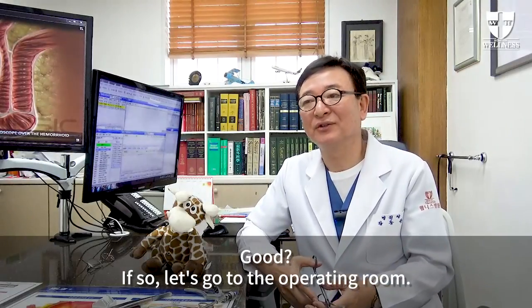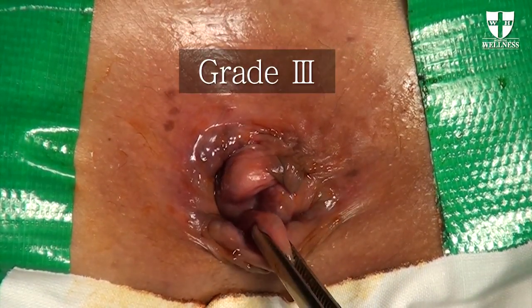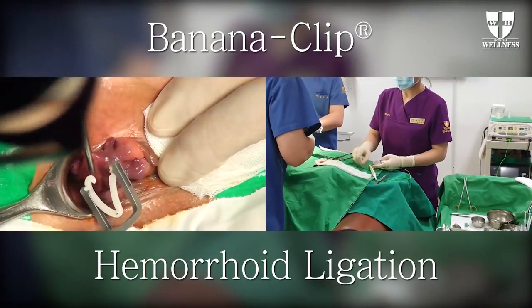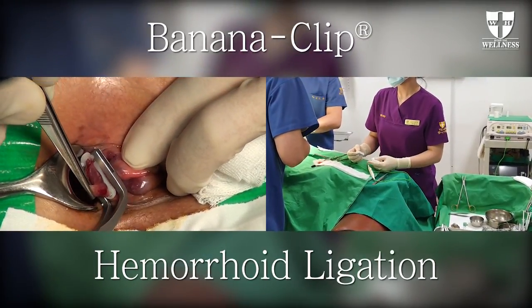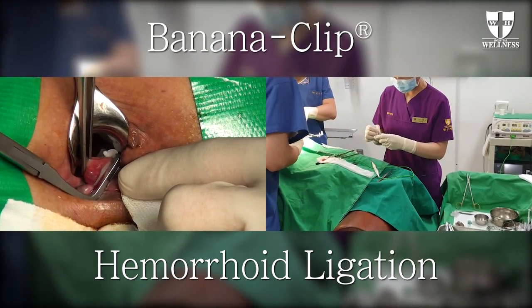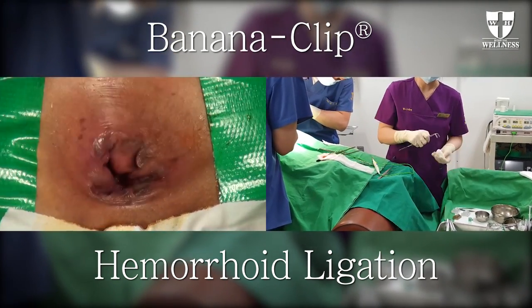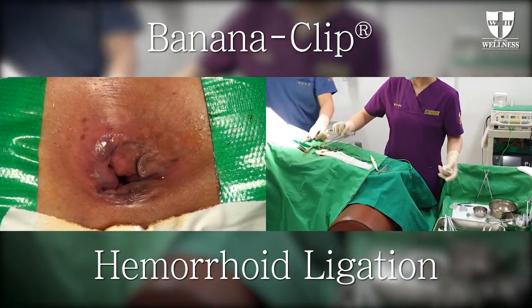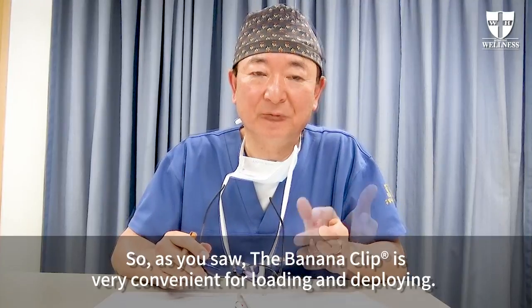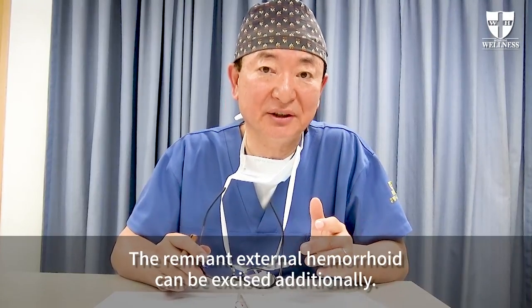Let's go to the operating room. As you saw, the banana clip is very convenient for loading and deploying. The remnant external hemorrhoid can be excised additionally.